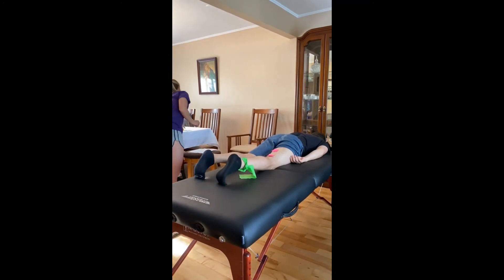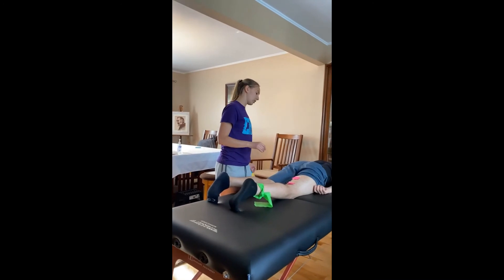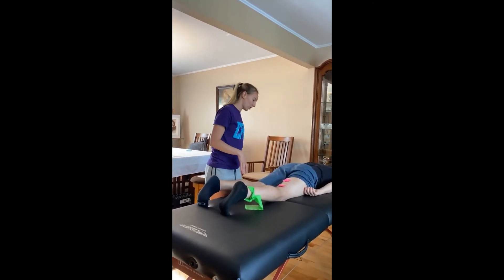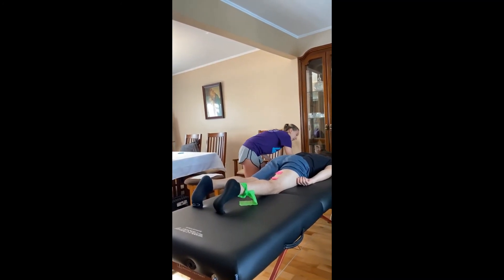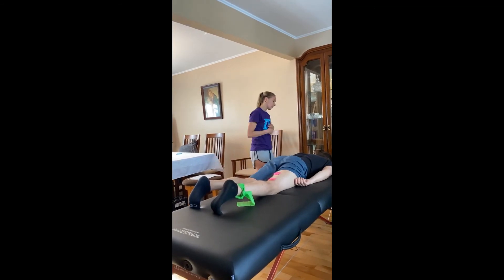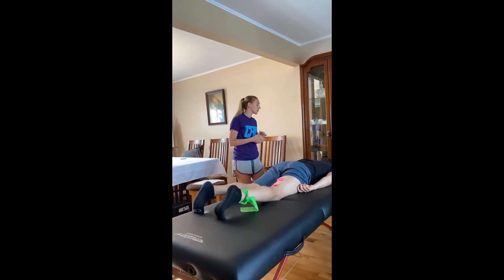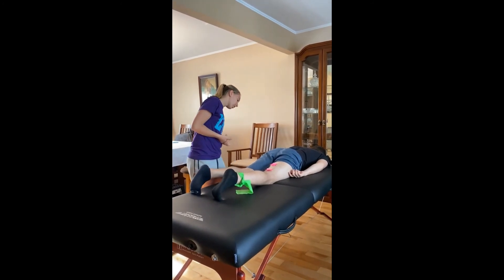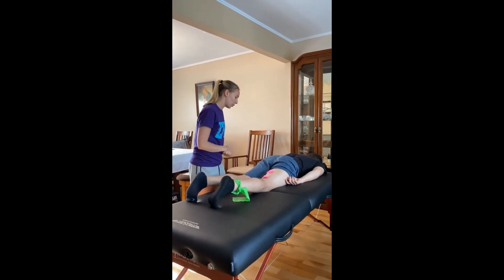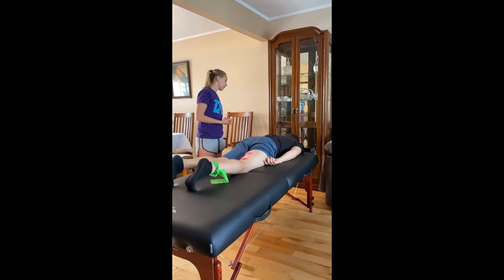Before I leave, I want to double-check this real quick. How does that feel right now? Feels good. I don't see anything abnormal with muscle tone or skin integrity, so that's good. Mr. Wealtel, I'm leaving you with the timer set to 20 minutes and the call bell. Let me know if you have any questions, concerns, or if anything feels abnormal. I'll be back to check on you in five minutes. Five minutes go by. I'm going to check your electrode placement — nothing abnormal with the skin or muscle tone. Is the intensity still okay for you, Mr. Wealtel? Yes, good.